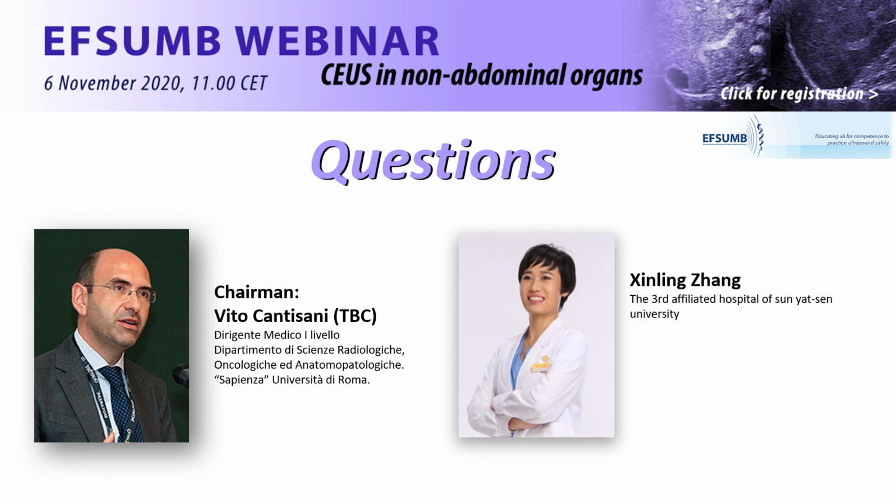In my opinion, we can do the CEUS examination during any phase. Don't be limited by the menstrual cycle, because we found that the agent perfusion is similar during the early phase or late phase of the menstrual cycle. There is no difference. We can perform it without choosing a time point, at any phase of the menstrual cycle.